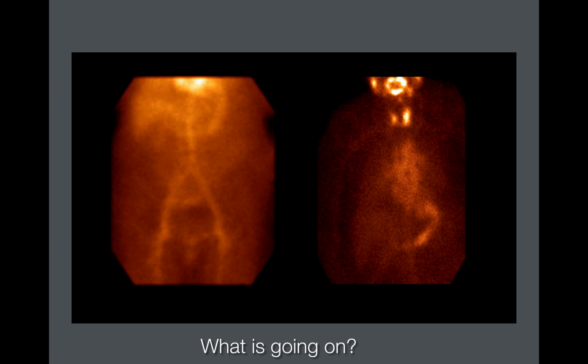Okay, so what is going on in this case? And I'm sure all of you have accurately recognized that this is free technetium in the stomach, as also evidenced by the free tech uptake in the thyroid gland. And this can be quite confusing. Again, for reasons not surprising, it more often occurs at night when the technologist is in a hurry to label and re-inject.